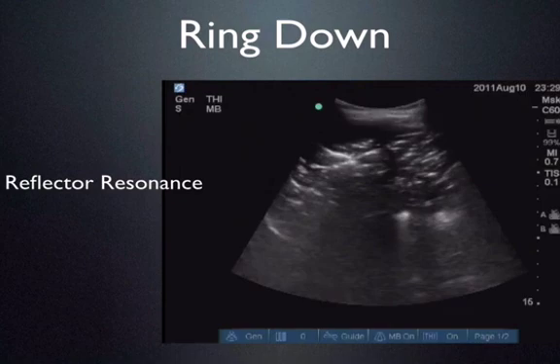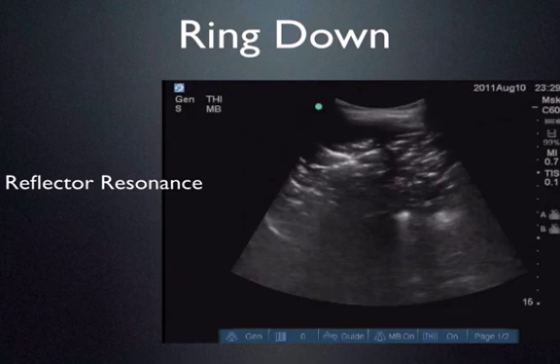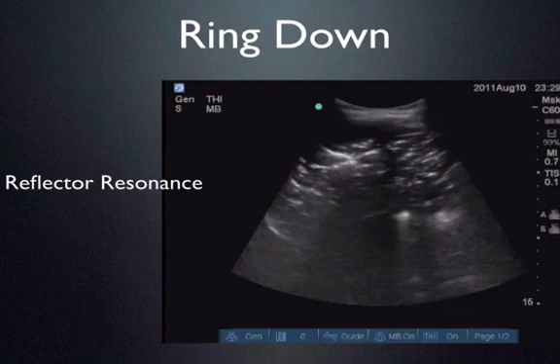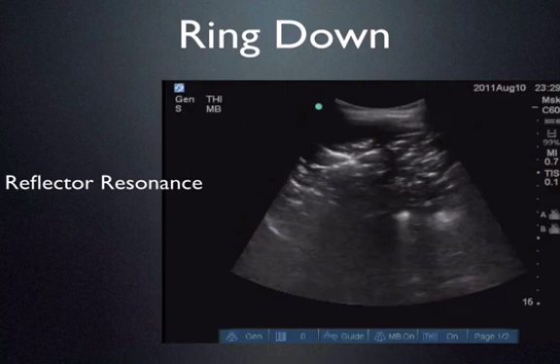Now let's talk about ring down artifact. Ring down artifact looks very similar to comet tail artifact and they are often confused. Ring down artifact is usually associated with air, and is also called air artifact. Air artifact shows a bright white leading edge with shadowing posterior. You can differentiate it from clean shadowing because clean shadowing is a frank black shadow posterior, whereas ring down or dirty shadowing has a mixed echogenic appearance in the shadow deep to the target. Ring down artifact exists because of reflector resonance — water molecules between air molecules actually vibrate or resonate, producing vibrations that are sent back to the ultrasound probe, which interprets those as echoes.